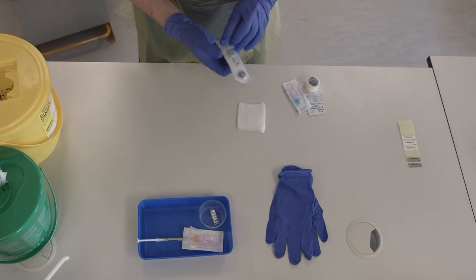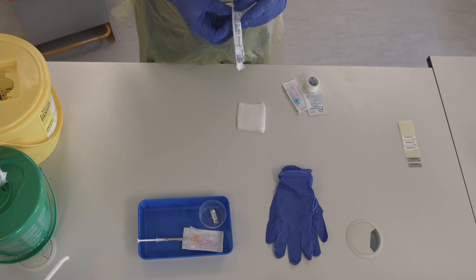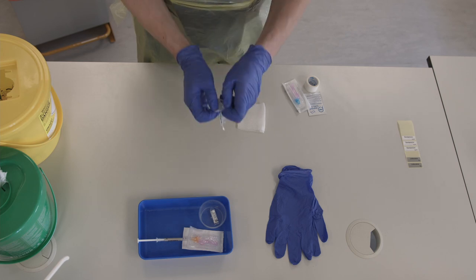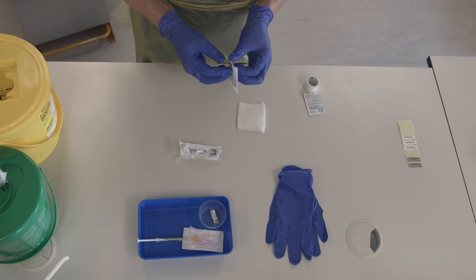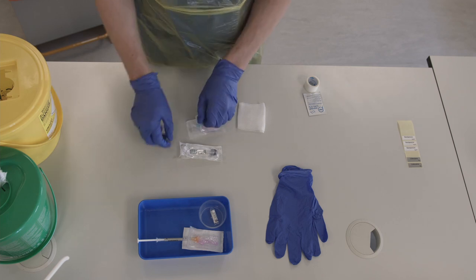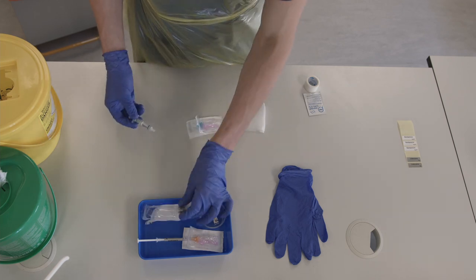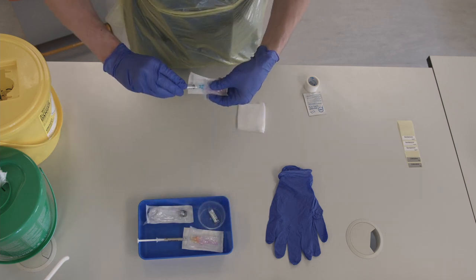Take an ABG syringe and a blue needle and open the back of the packets. Keep the top of the ABG syringe in the packet, connect the syringe itself to the blue needle, and then put it in your tray.